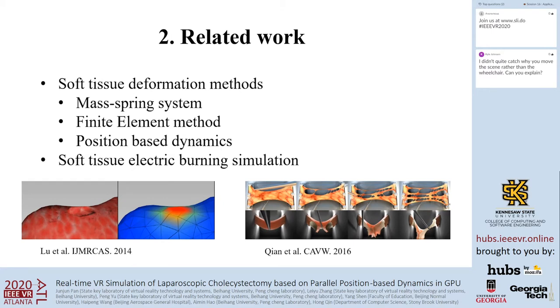We investigate a number of soft tissue deformation methods, such as FEM, mass spring model, and PBD. We also study the simulation of electrocautery. Our research aim is to accelerate the deformation of soft tissue on GPU and improve the realism of fat tissue burning.